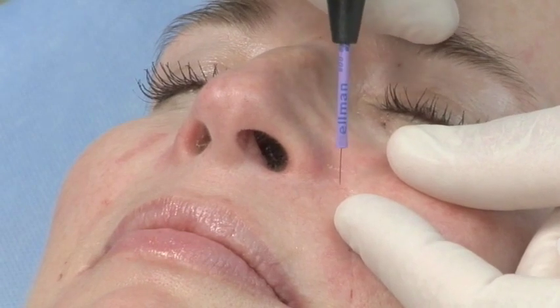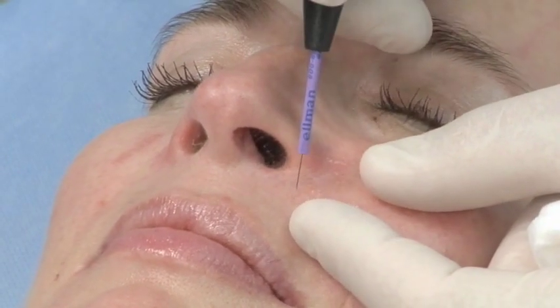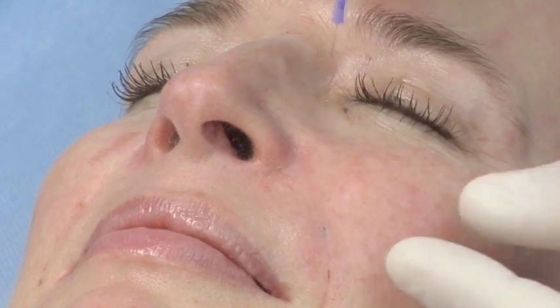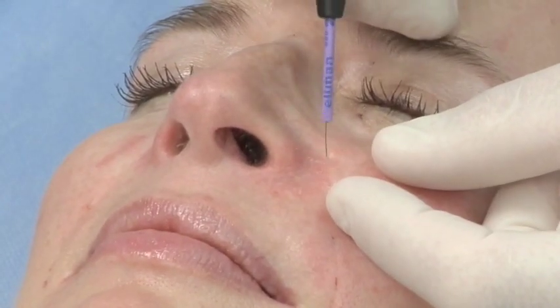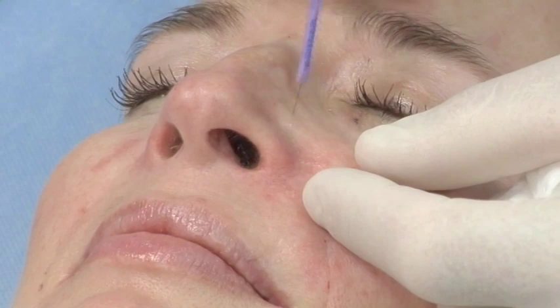I've had these done in a very sensitive area. Especially if you're trying to laser these areas, that's really, really uncomfortable. I won't lie, it is uncomfortable certainly, but compared to some other methods of addressing these, I think the pain is less. You can see this is just a really immediate result with almost no erythema. The nice part is you can be just barely beneath the surface of the skin with this very pointed wire.